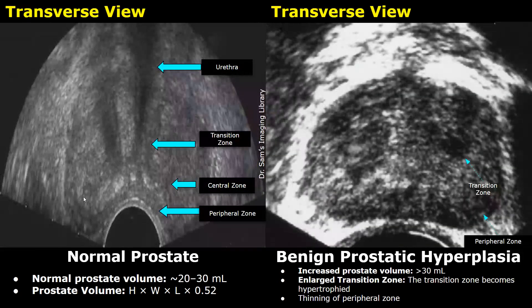In this image, the central zone is between the peripheral and transition zones. The echogenic area is the peripheral zone, the hypoechoic area is the transition zone, and this is the urethra. In BPH, the prostate may become more rounded in appearance and more hypoechoic and heterogeneous, with an enlarged transition zone.